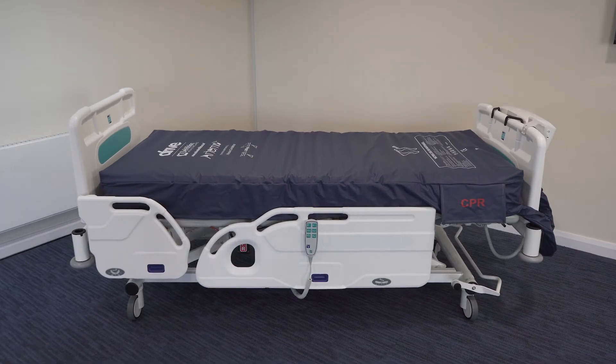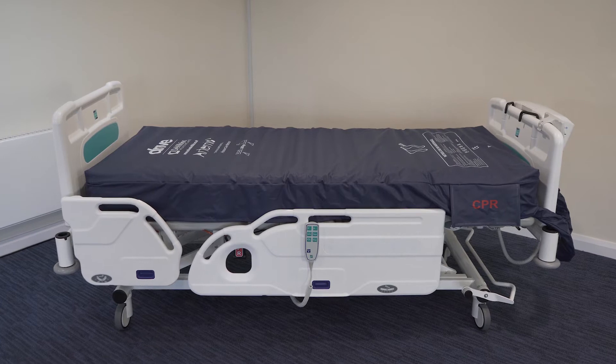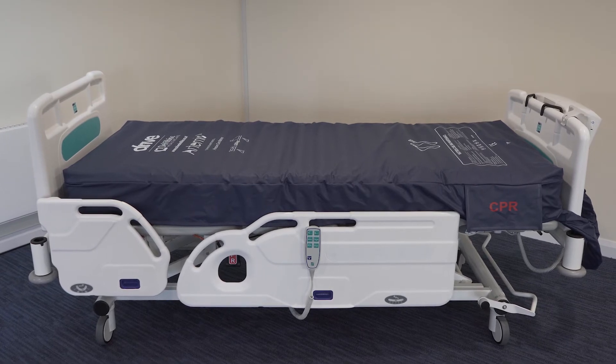The Artemis II Dynamic Mattress is a triple therapy system: alternating therapy for effective pressure relief, constant low pressure for optimum low pressure, and pulsation therapy.